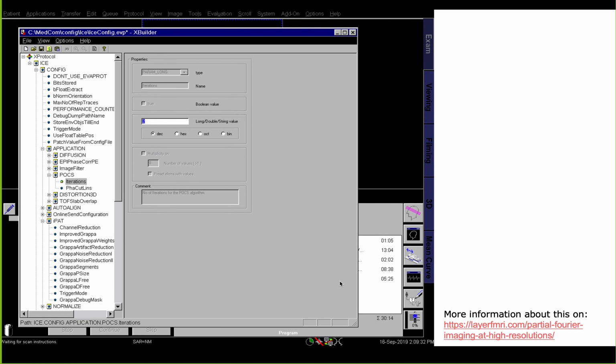All right. Another thing that we are usually forced to do with high-resolution layer-dependent fMRI is partial Fourier imaging. And in partial Fourier imaging, we take advantage of the fact that k-space is Hermitian symmetric. This means that one side of k-space is usually a mirrored function of the other side of k-space. And some people call this asymmetric echoes, I think on Bruker scanners and Philips scanners. On Siemens, we usually call this partial Fourier imaging. There's also a blog post about it and what it does.